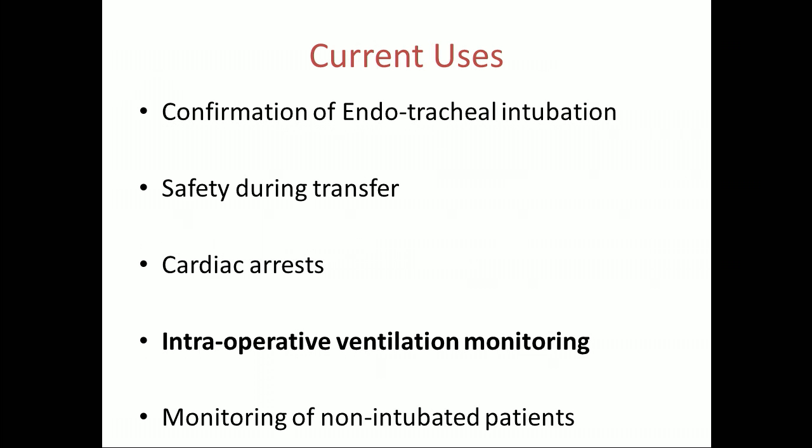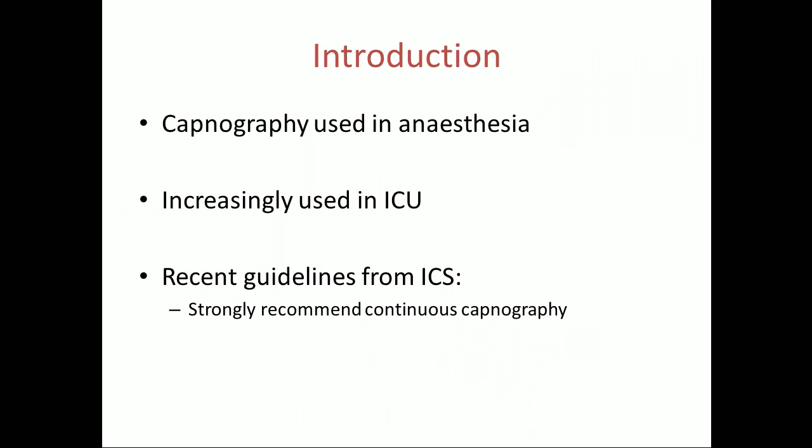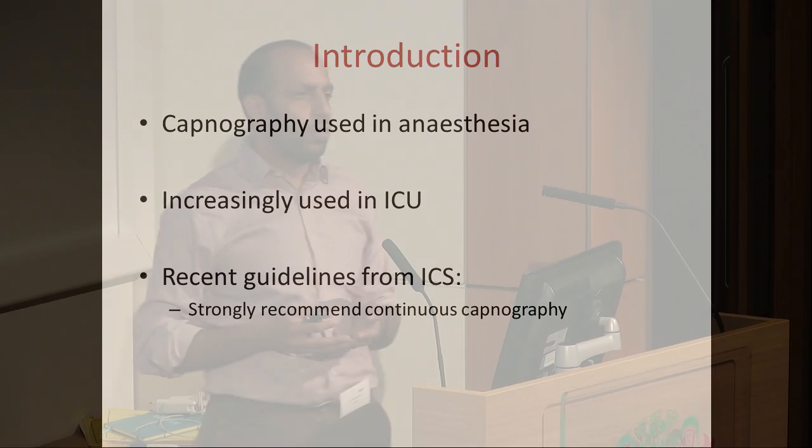So monitoring end-tidal CO2 in its traditional form, i.e. time-based capnography, is in widespread use in hospitals. In the emergency setting, it's used for confirmation of endotracheal intubation. It's used to look at the efficacy of chest compressions. And moving on from that, in anesthesia, continuous time-based capnography is ubiquitous. It's slowly also integrating its way into critical care practice. It's almost standard of care now for inter- and intra-hospital transfers.